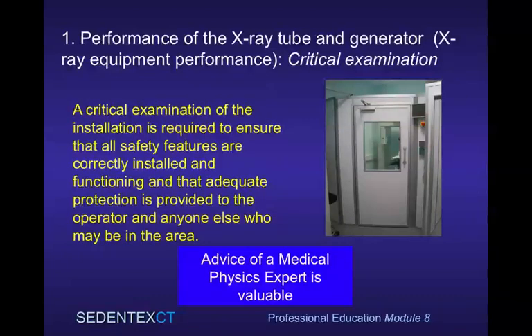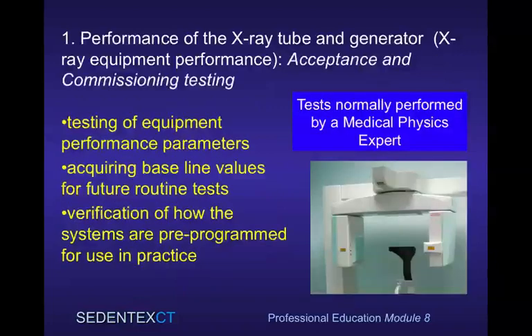The critical examination of a cone beam CT installation is required to ensure that all safety features are correctly installed and functioning, and that adequate protection is provided to the operator and anyone else who may be in the area. For this, advice of a medical physics expert is valuable.